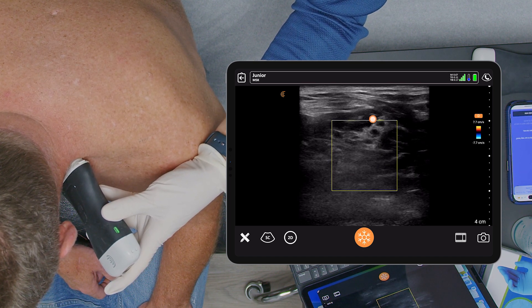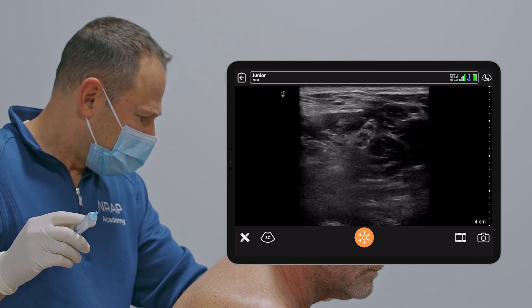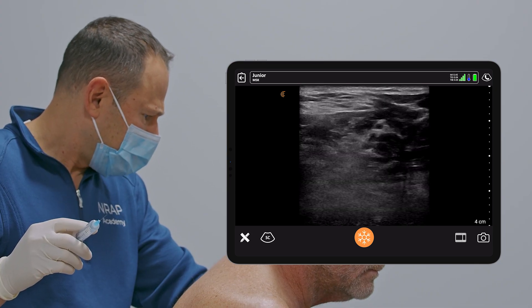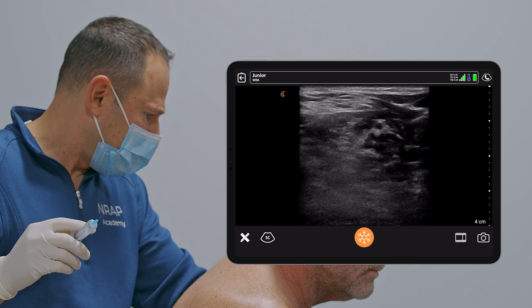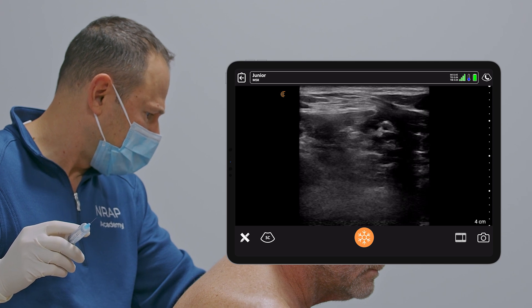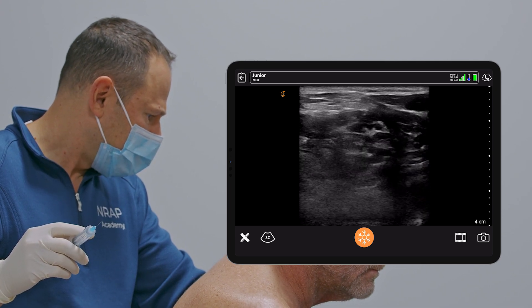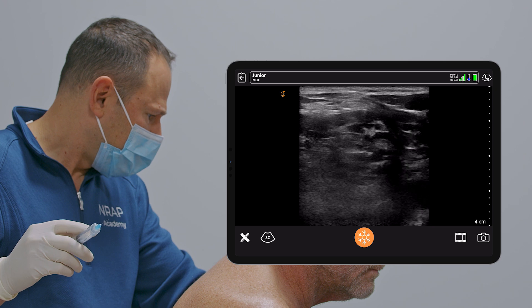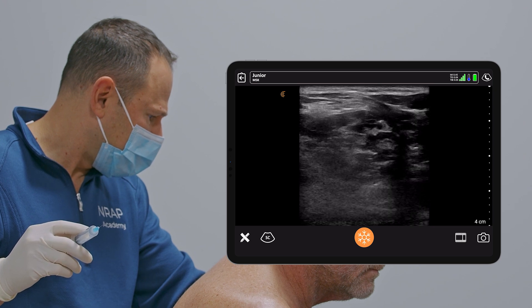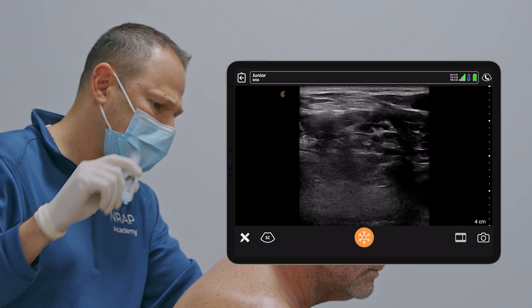Here are the nerves once again. C5-6 is stenotic, and he has impingement of C6 as well as C7, which is centered right here. I'm going to deposit a little bit of local anesthetic with dexamethasone in the vicinity.